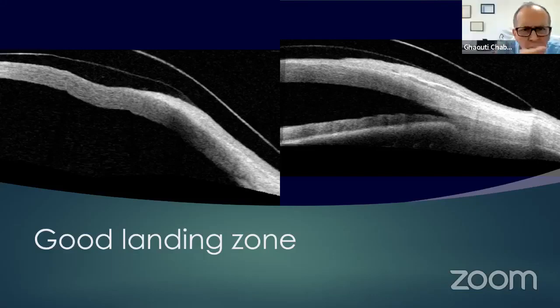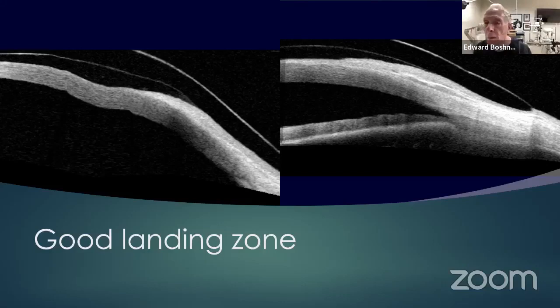So you don't use trial lenses at all? I have trial lenses. My diagnostic lenses are all 4 diopter reverse. The trial lenses I really use a lot are Jupiter scleral lenses. I have them in all diameters: 15.6, 16.6, up to like 18, and also 20 millimeter scleral lenses, but they're all reverse geometry. A little thing I've learned over the years, my life is easier when I design lenses with reverse geometry design.